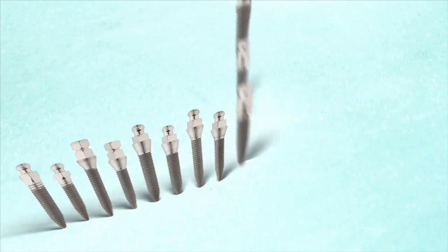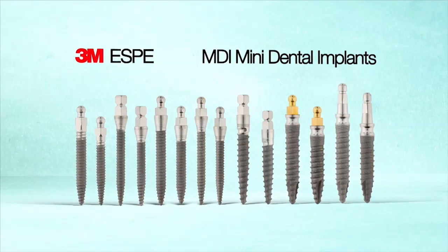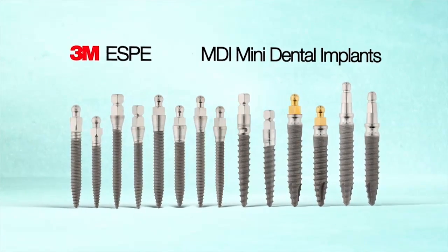All of the tools required to successfully perform MDI dental implant procedures are available from your 3M Dental Clinical Support Representative.